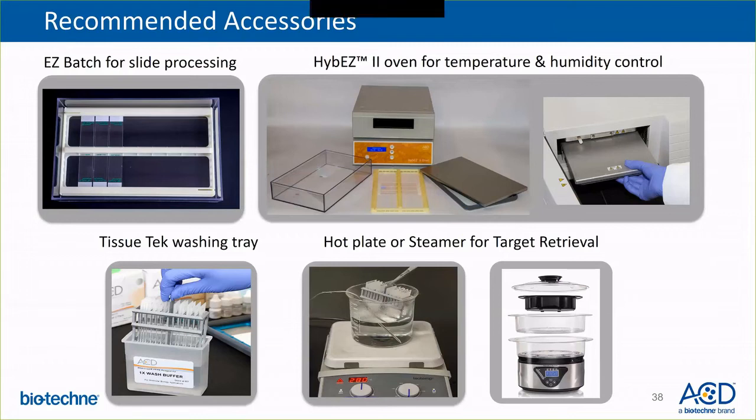The hybridization system to the right is designed to maintain the optimal temperature and humidity to ensure optimal and consistent RNAscope and BaseScope staining. We do not recommend using your own hybridization systems for running RNAscope assays. Shown below are the two methods for carrying out the heat-mediated target retrieval steps, which are required for sample types such as FFPE and fixed frozen. Our website has training videos on different steps of the manual assay, which is a great visual guide to assist with running the RNAscope manual assay.